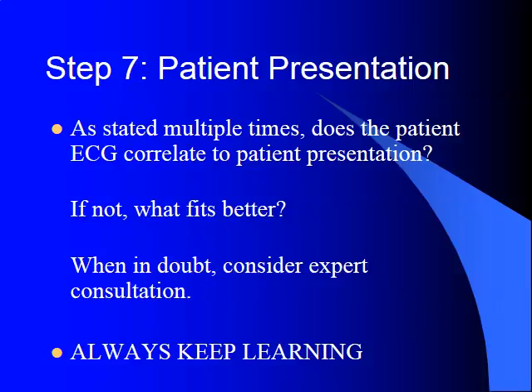As we've already talked about in multiple different areas of this lecture, patient presentation is step 7, and that's just an overall thought process that you need to be considering on all of your EKGs. Does the EKG correlate to the patient's presentation, complaints, how they look, how they're describing their pain to you, everything? If it doesn't fit, then what fits better? And when in doubt, always consider expert consultation by medical control, and always keep learning. There's a lot of information on EKGs that you can learn about. There are some great texts that you can get if you take interest in EKGs.